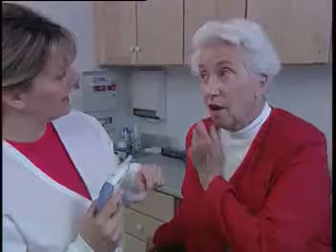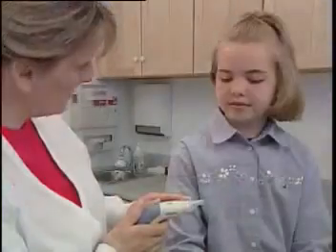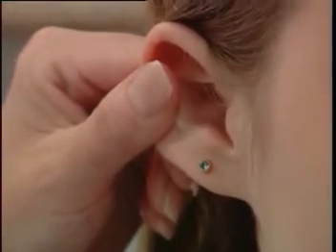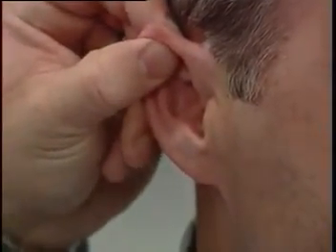Because patients have varying thresholds of comfort during cleaning, it's a good idea to introduce the sound of the ear wash system suction to your patients before the procedure in order to make them feel more comfortable, and to continue asking for feedback during the irrigation. To irrigate the ear, grasp the subject's pinna. Gently pull back to straighten a child's ear canal or up and back for an adult.